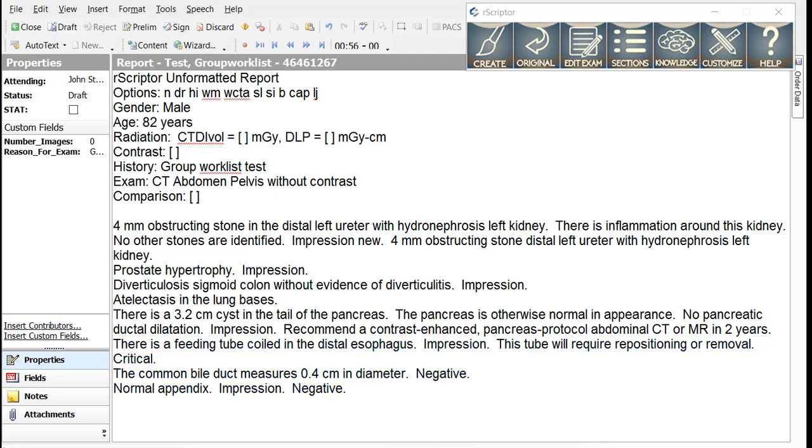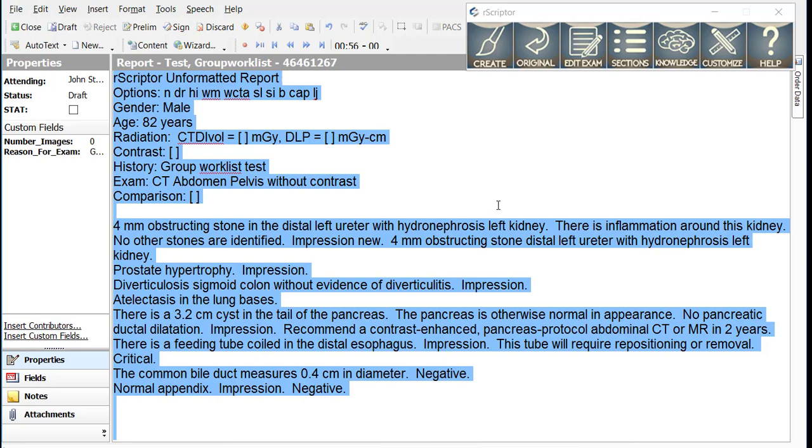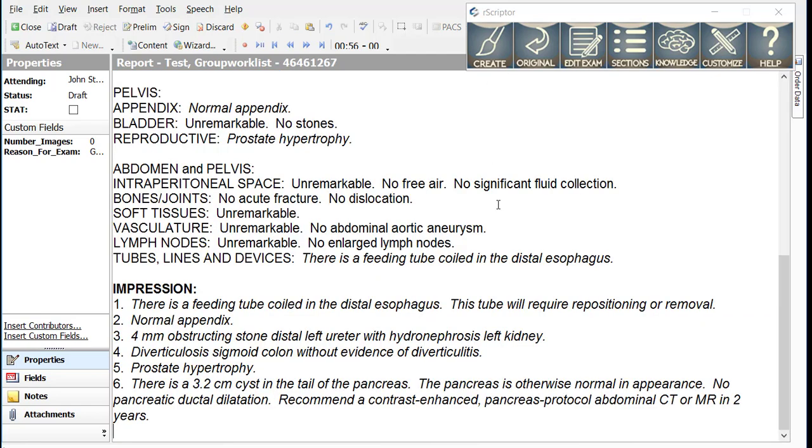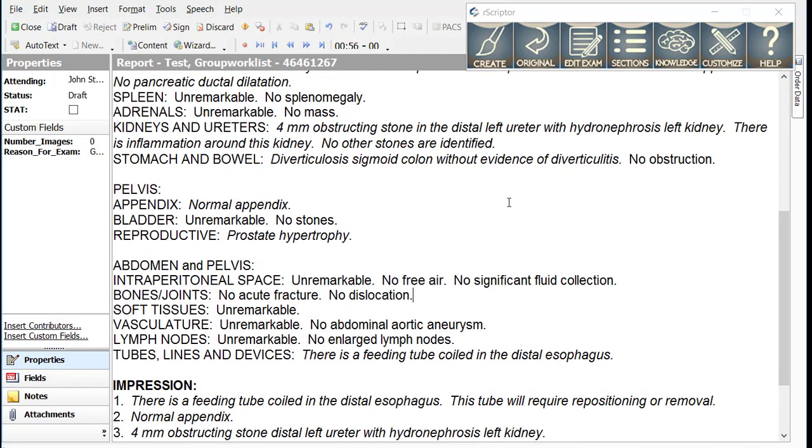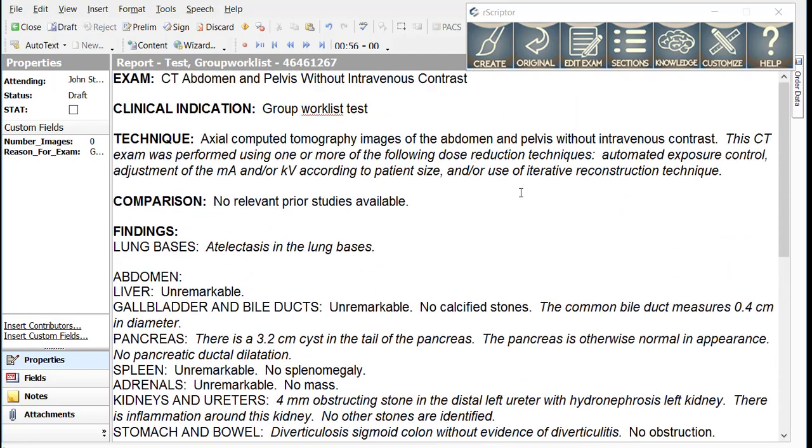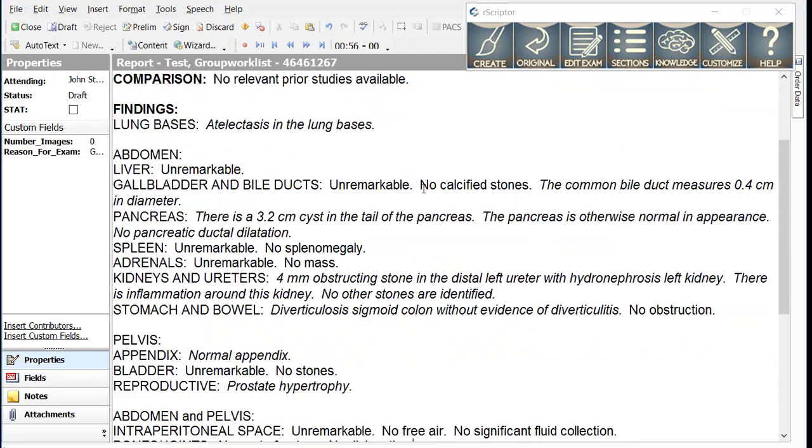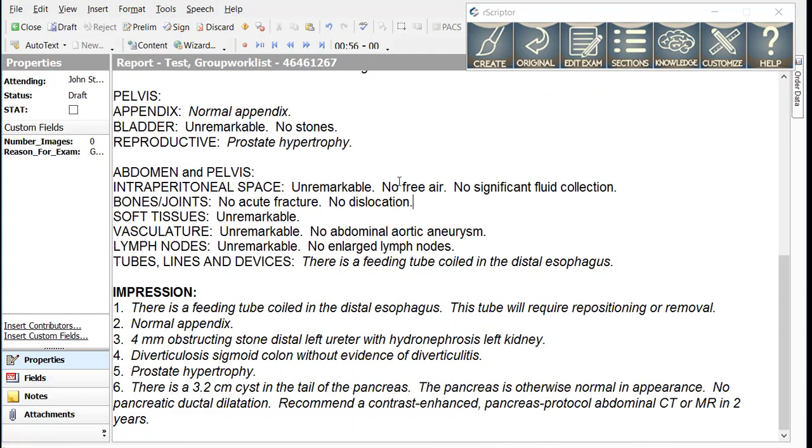With the several additional findings, we are now ready to create the report. As before, the findings are placed in the findings section and the keywords impression period and impression new period are used to generate the impression section.